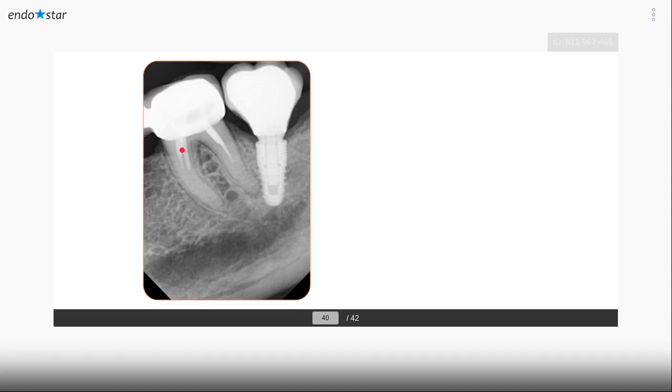So what we can do, we can start by removing with ultrasonic, and then we can go with our Reendo instruments, and they will go up to this point. And after that, usually when the previous doctor made a new canal, he went to the dentinal wall, and he missed the main part of the canal. So we always say he transported the canal. So what we have to do now, we have to find the real direction of the canal.